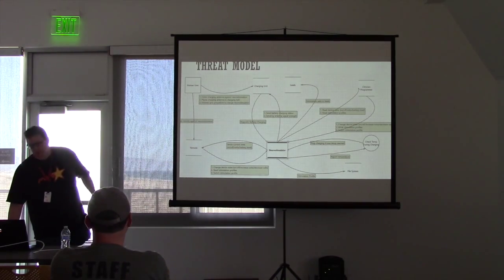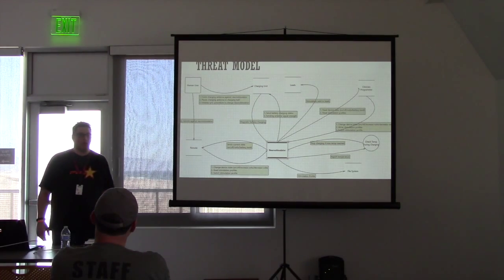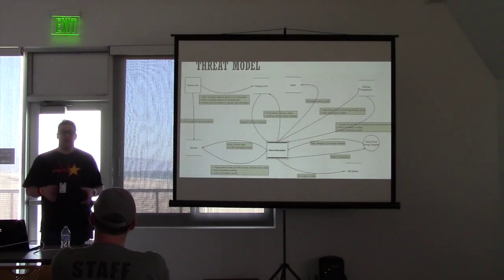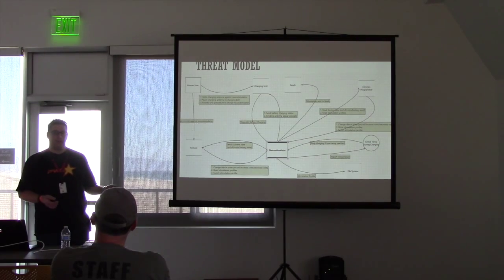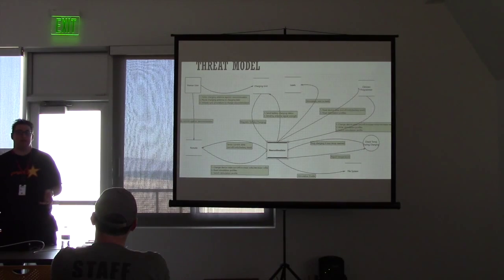So let's get a little deeper into the threat model. This is something I drew out. I did it for a couple different products that they had. I looked at recalls on devices, and at what doctors or patients were complaining about as far as damage to the skin that wasn't necessarily security related, but could have been taken advantage of from a security standpoint.